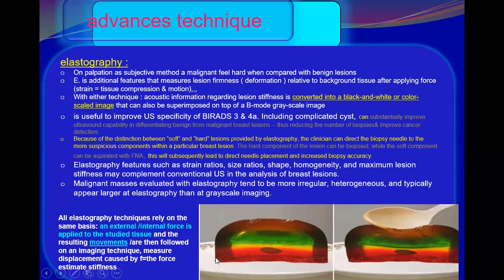If you imagine this is a breast and here are the lesions, by applying force here, all the tissue will definitely move, the breast tissue as well as the lesion inside the breast tissue. What is the role of elastography?